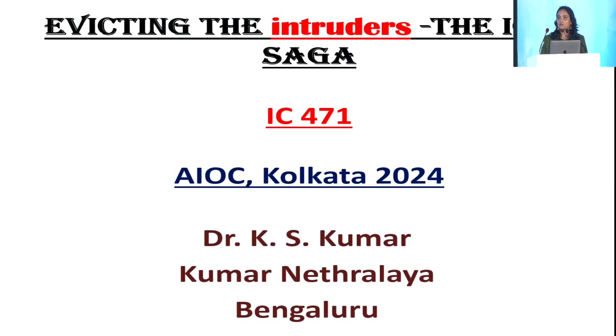Today I'll be talking about evicting posterior segment intraocular foreign bodies. Most of the foreign body cases that we get are because of patients indulging in metal on metal activity in garages or lathe machines.